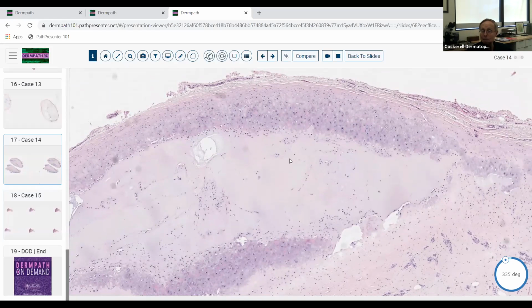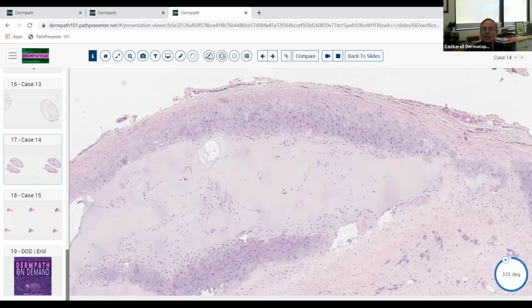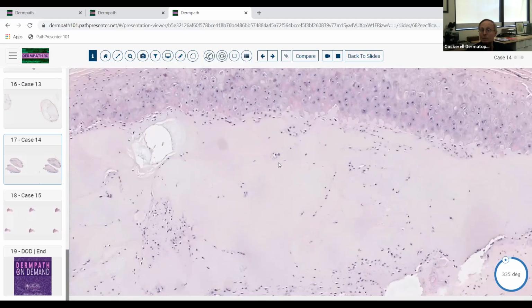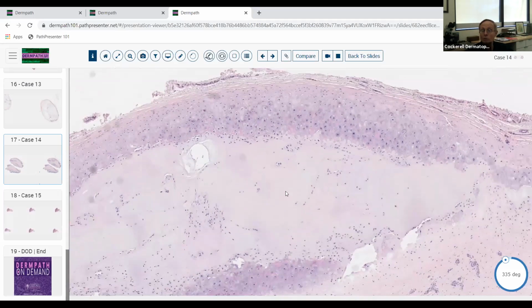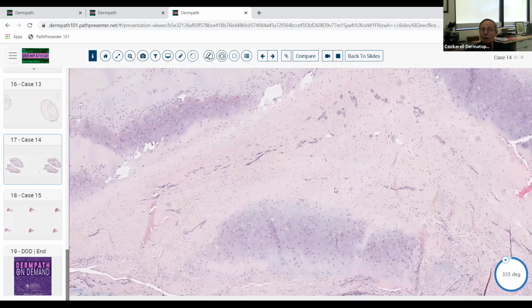And basically what happens here is that the cartilage gets damaged, usually with somebody that gets kind of blunt trauma. They get slugged in the ear by, like, boxers get this all the time. Wrestlers get this, you know, when they're getting put in these head vices and things like that. They crush their ears, they damage their ears, and they get cauliflower ears. So if you biopsy somebody's got that ugly looking cauliflower ear, this is what it looks like in the acute stage when the cartilage is undergoing degeneration. And this is what it looks like in the chronic stage.